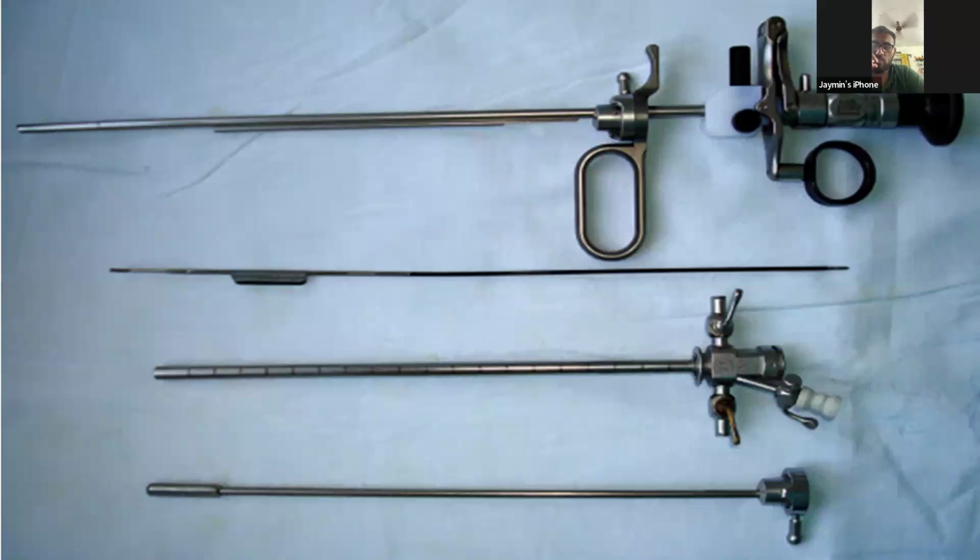So the sheath which has the channel on the top allows us to park the wire across the stricture, sir. Also, if we are using a half moon channel with the sheath, then after completion of the procedure, if we have doubt that the catheter insertion over the wire might be difficult, then we can place the half moon sheath inside the bladder, remove the VIU sheath, and on top of it, we can pass the catheter into the bladder.